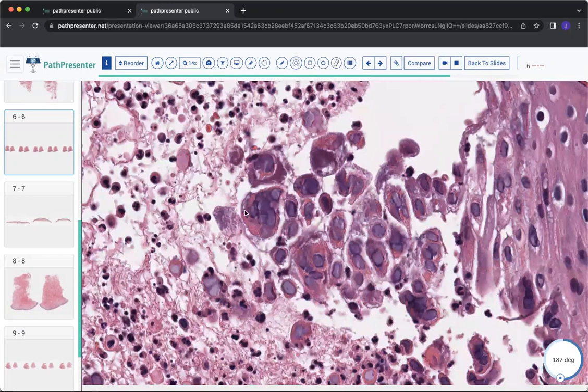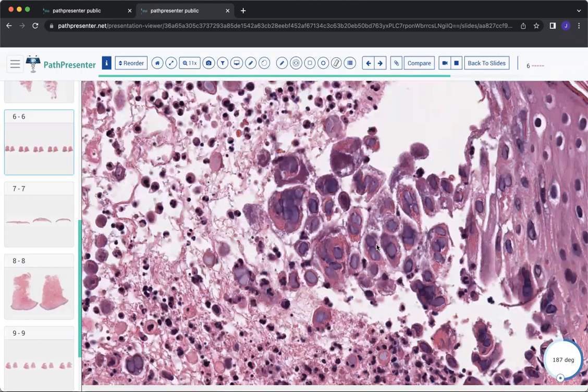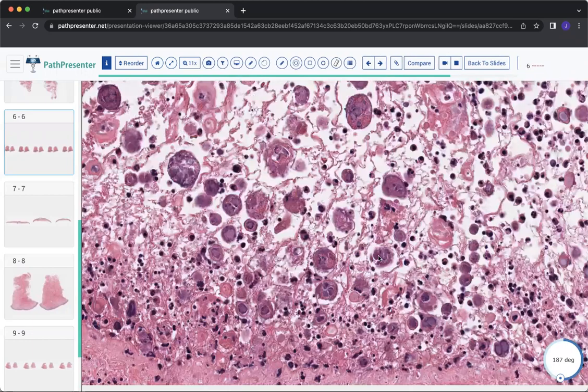You're seeing collections of nuclei here forming multinucleated giant cells. You're seeing some areas where the chromatin seems to be going dark to a darker rim on the outside, and that's kind of like a margination effect. And you can even see that the nuclei are kind of smashing together and molding together. So we've got molding, we have margination, and we have multinucleation, the 3 M's of herpes virus infection of the skin. So you have to be able to recognize this on H&E.